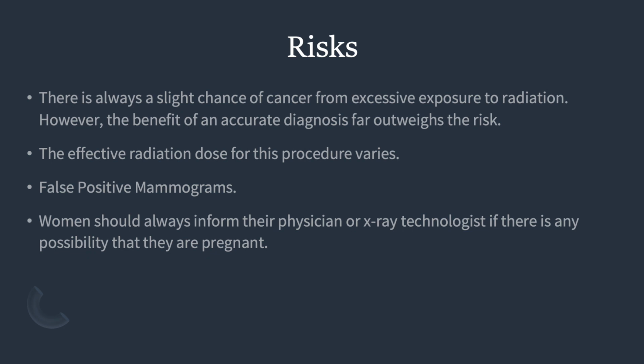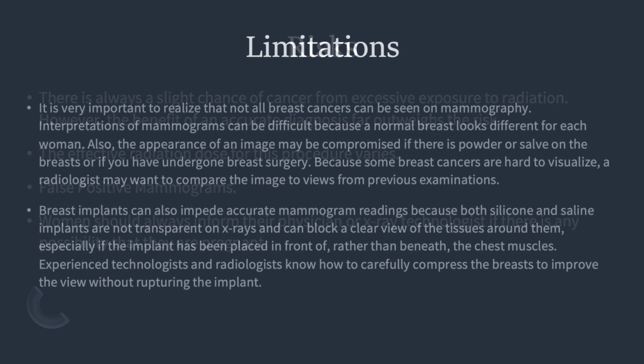We also have false positive mammograms, where 5% to 15% of screening mammograms require more testing, such as additional mammograms or ultrasounds. And women should always inform the physician or X-ray technologist if there is any possibility that they're pregnant. Now let's talk about limitations.